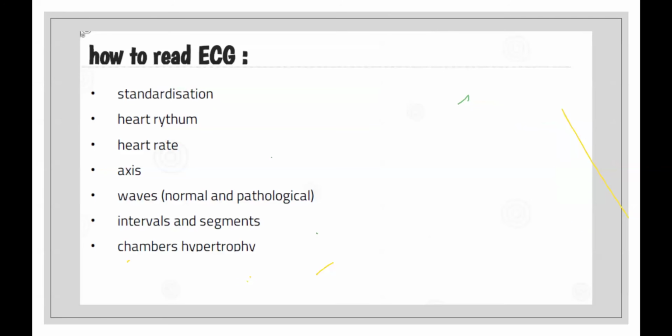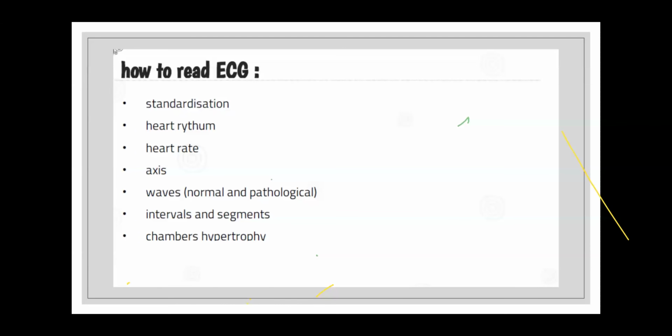Now, how to read ECG? Now, this is our basic talk. Before that, we were only talking.